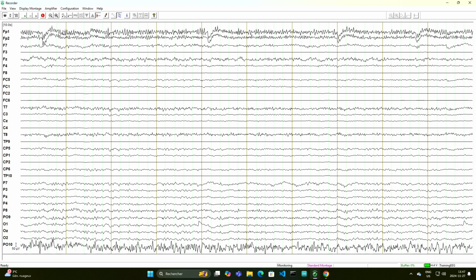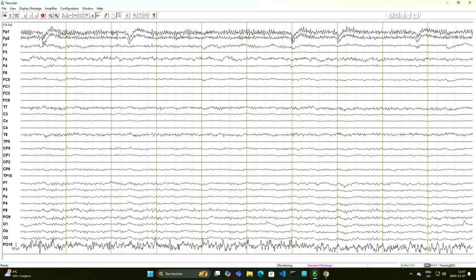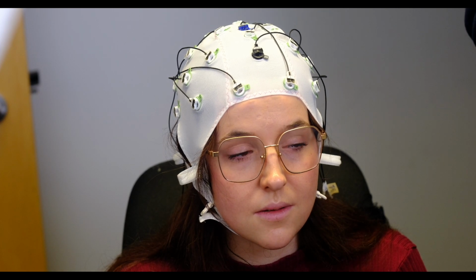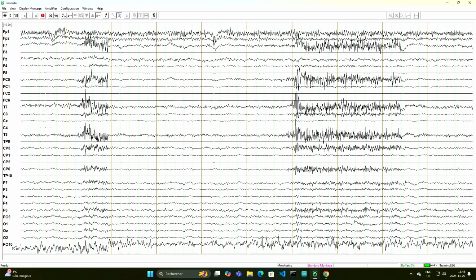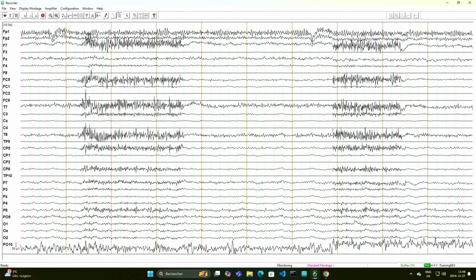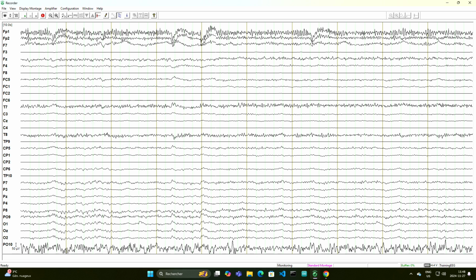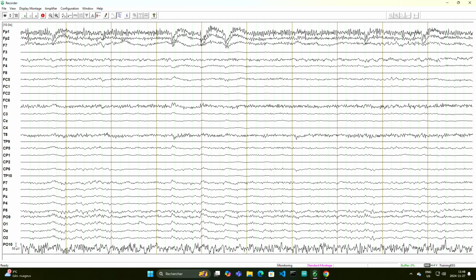These sorts of muscle flexations cause very strong electrical signals that can traverse all the way from their origins up into the scalp. So I'm going to ask Anne right now to please clench her teeth, and you'll see the amplitude change on the raw signal. And stop. Again. And stop. So you can see instantaneous change in the amplitude of the signal as Anne has this flexation in her jaw.